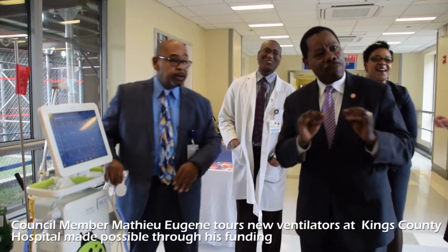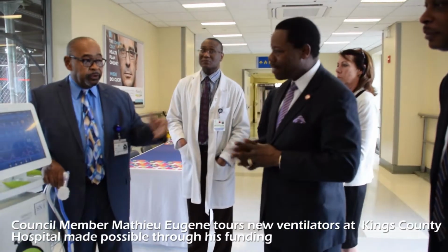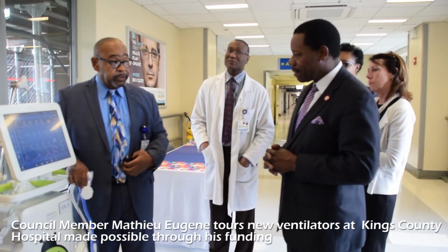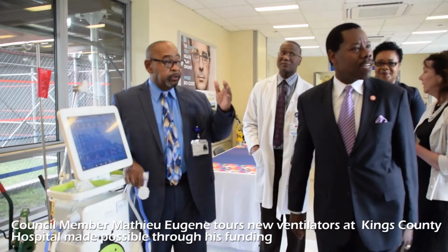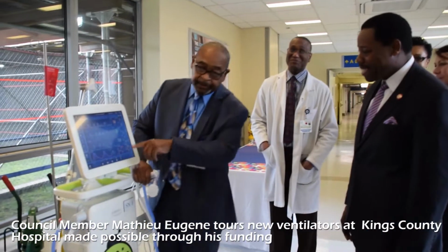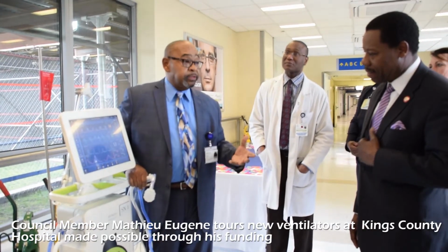It's remarkable to see the machine interact with the electricity. Absolutely. Because you know the signal starts in the breathing center, travels via the phrenic nerve, and once it gets to the diaphragm and the action potential changes, the sodium-potassium pump is activated. Going back to physiology, right? That's right. My biochemistry. Now, this is a simulation, but what this represents is the actual contraction of the baby's diaphragm, the strength of the contraction.